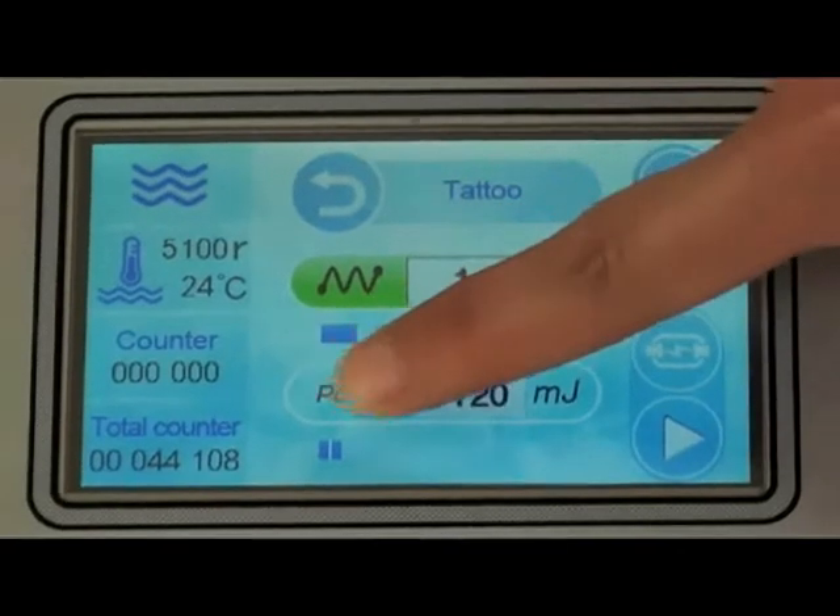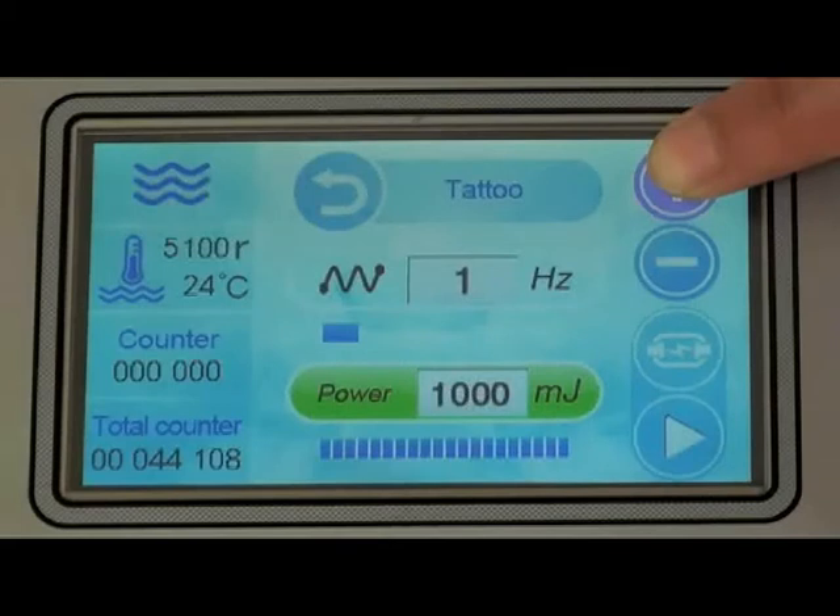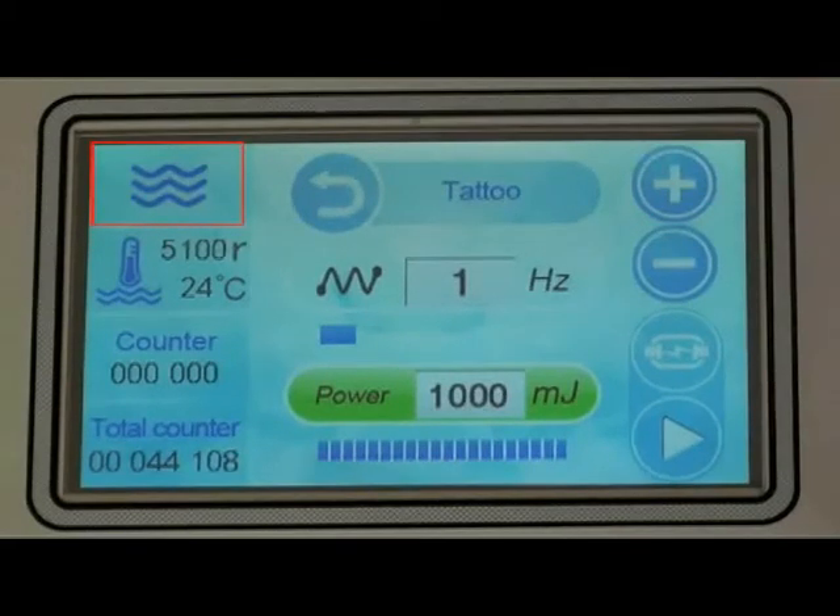Choose power and press plus or minus to adjust the power. Power means the output energy of every flash, adjustable from 0 to 1000 millijoules. The water flow display shows the state of water circulation. Water temperature displays the water temp state. Counter displays current shooting times; total counter displays total shooting times.